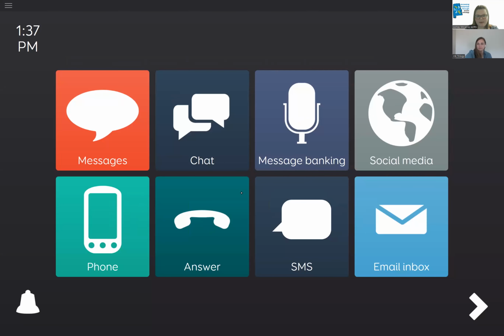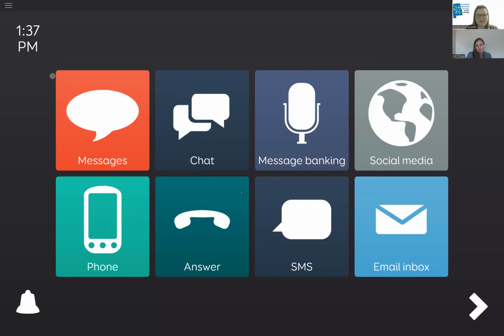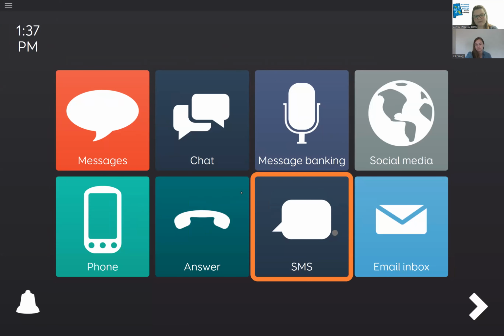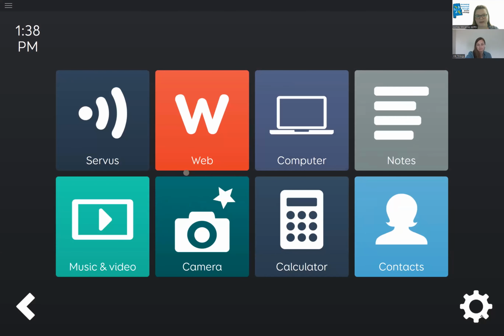So it's like apps within apps within apps. Yeah. Kind of. Which one are you on right now? Fast Talker? This is Fast Talker, yes. Okay, so like you were explaining to me the other day, if a client chooses Fast Talker as their preferred grid set, here's the apps that are defaulted in there, but you can pull in some additional things to the Fast Talker grid set. If you create pages elsewhere for the user, you can pull those into this nice, neat folder. It's basically like a folder within Grid 3 called Fast Talker, and it's set up really nicely to use.